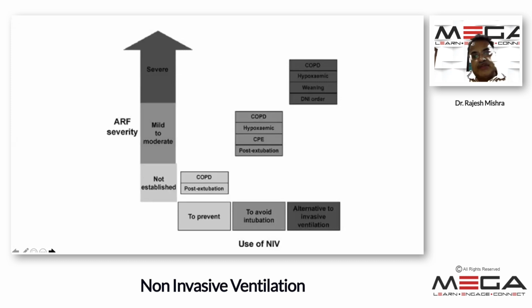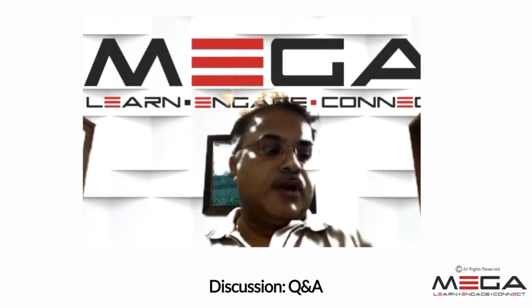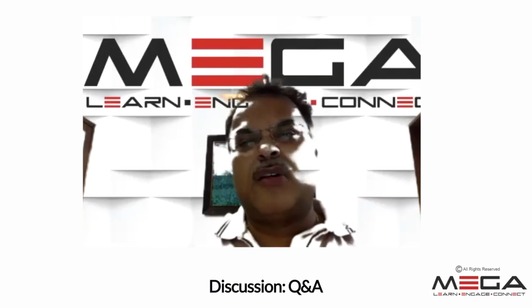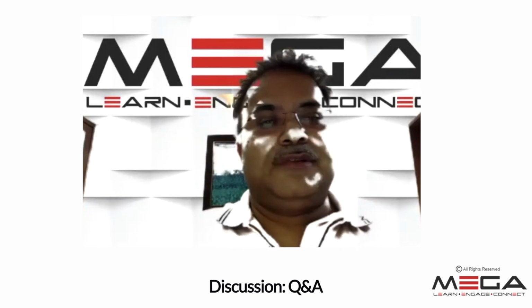If the patient has severe disease, definitely NIV helps, but sometimes this patient needs invasive ventilation. But appropriately used, NIV in COPD, hypoxemic respiratory failure, and acute cardiac pulmonary edema helps as an alternative to invasive therapy, or may even avoid invasive ventilation. Thank you for all your attention, and I hope I have stayed around my 5 minutes of time. Sorry for that.